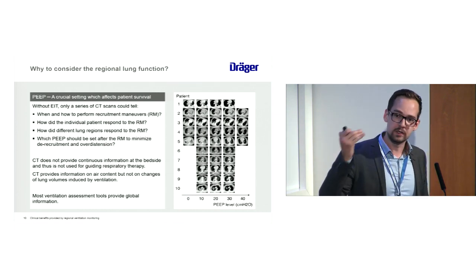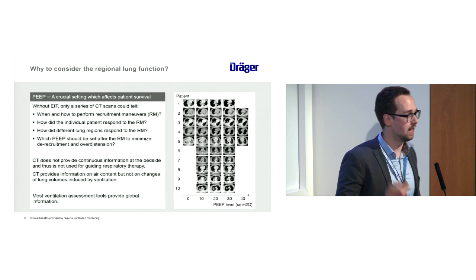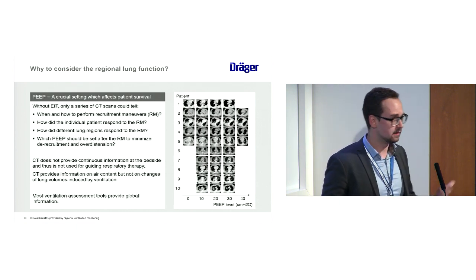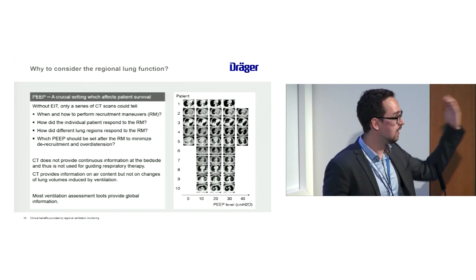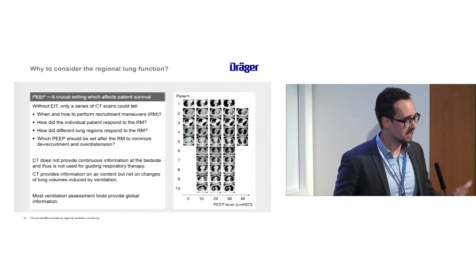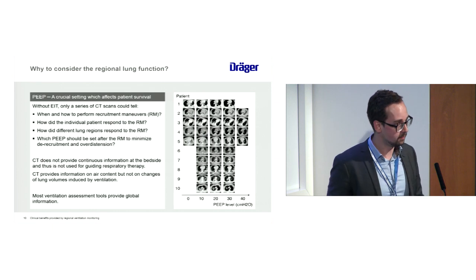However, we're still interested in finding out how to perform, or when to perform, a recruitment maneuver. Is a recruitment or a high PEEP strategy the right thing for my patient right in front of me? As we've seen in the literature, there are confusing or mixed signals regarding a high PEEP or a low PEEP strategy. But I think what all of these have in common is that we need to truly see if our patient is responding to this kind of treatment or not.